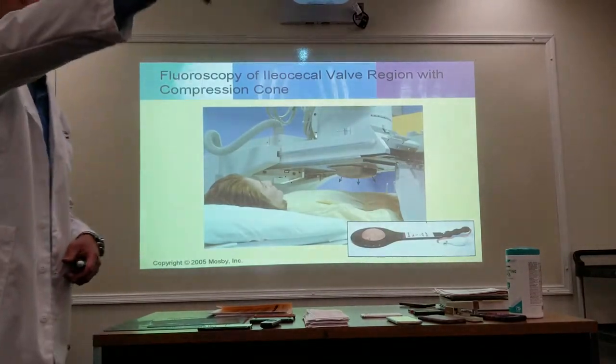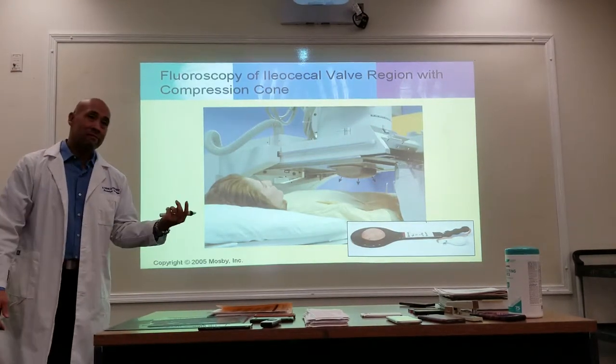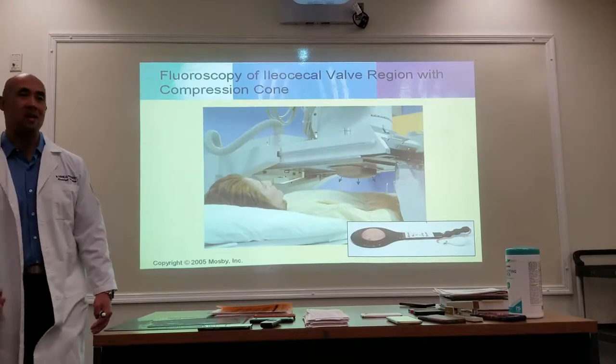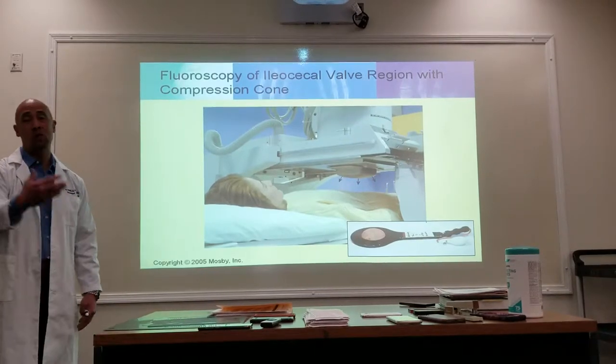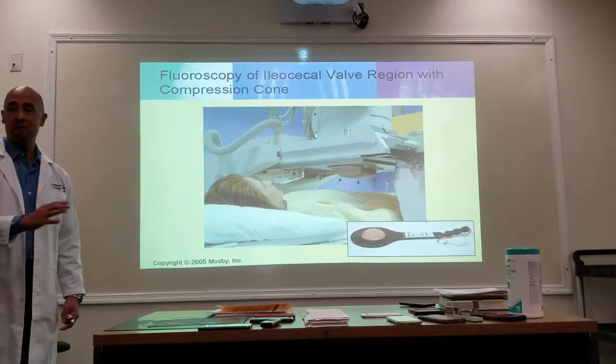But going back to Kate's question, well, what if they can't lay on their belly? Then you do APs. There's no set rule that says you have to do PA, okay? But based on the patient's condition, you may not have that option, so you have to do AP, okay? But we prefer PA.